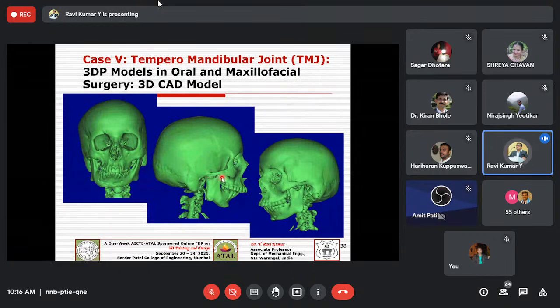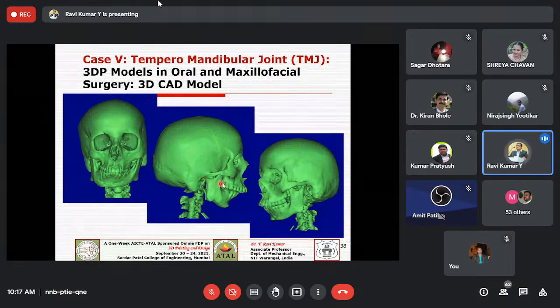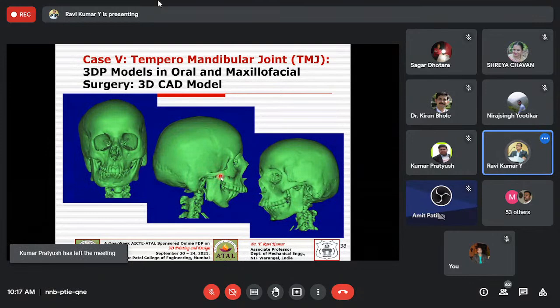And this is what I'm talking about. If you see this joint from the ramus portion, from the mandibular to the zygomatic portion onto the maxilla side, it should have normal articulation, meaning it should have form and easy opening. This joint is responsible for the easy opening of the mouth, but this joint got fused. That is the major problem, and it should be operated on, and we should reconstruct this joint. If you ask an oral maxillofacial surgeon how complex a TMJ reconstructive surgery is, it is quite challenging, as we need to retain this joint.